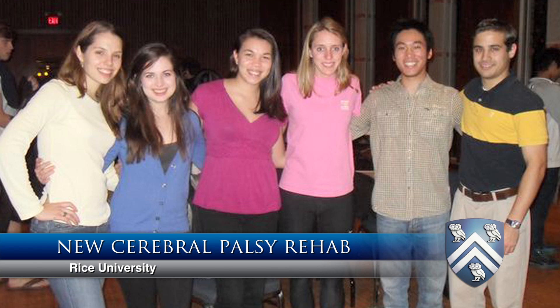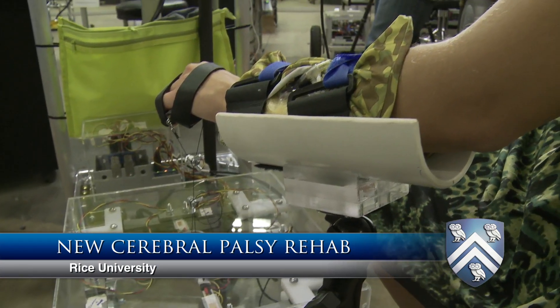We are RICE Helping Hands and we have developed a wrist rehabilitation device for children with cerebral palsy. The patient's muscles are essentially locked in a spastic position. Our mentor, Dr. Gugola, actually cuts the muscles and switches them from the underside to on top of the wrist, which straightens the patient's wrist out. While they now have movement, these patients have never really used these muscles before, and so their next task is to rehab them.